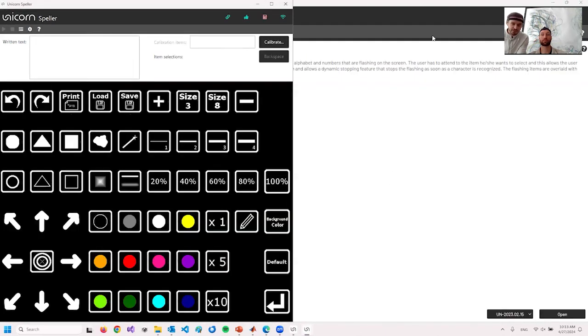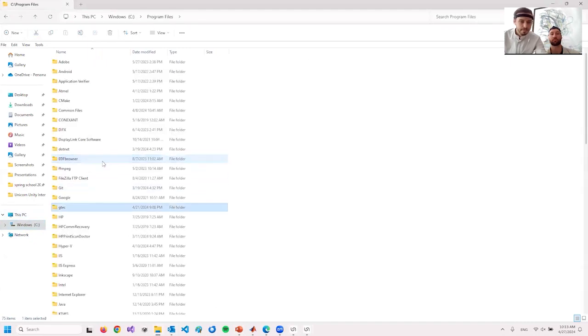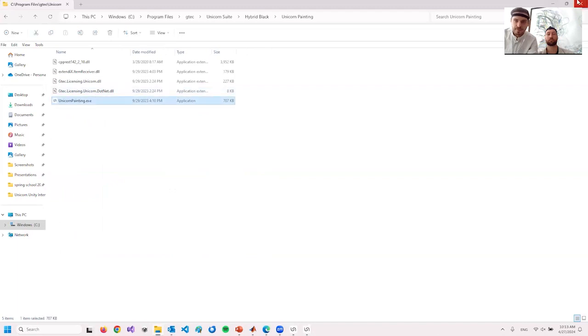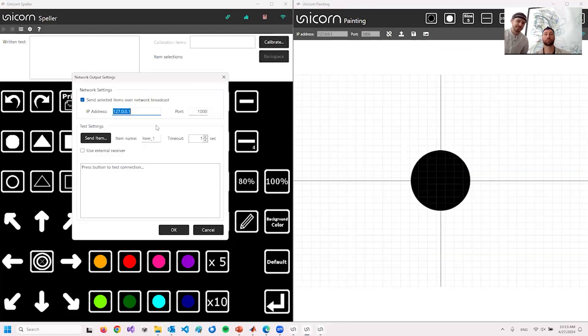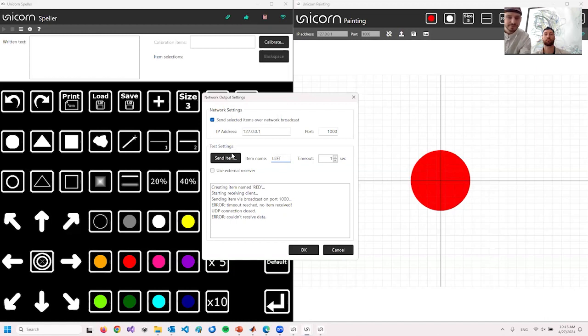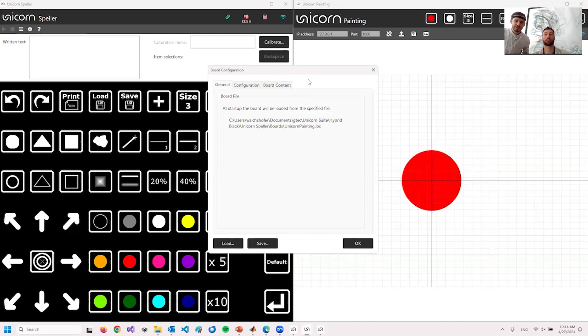To give you some better idea how that would look like, I'm opening the painting as well. This would be an example how you could use this network output from the Unicorn speller to control something in the painting. So we would connect this application via UDP to the Unicorn speller, and then we could simulate a BCI selection, like turning the item to red. Then the item turns red, or we can move it left, then it would move left. So I hope you get an idea how you could use the Unicorn speller to control your own software.